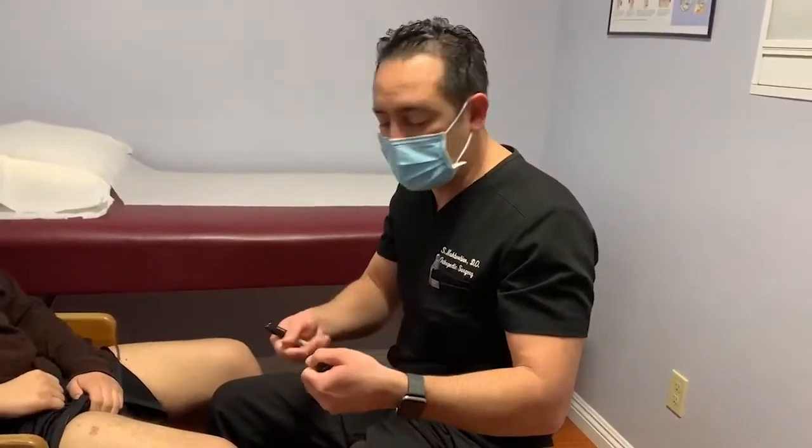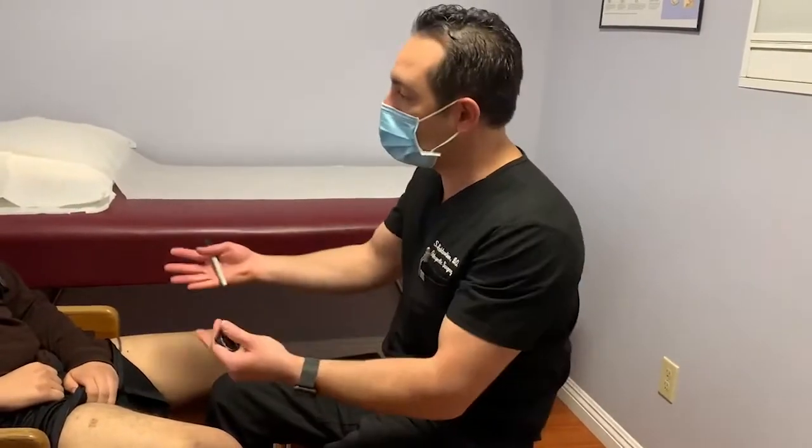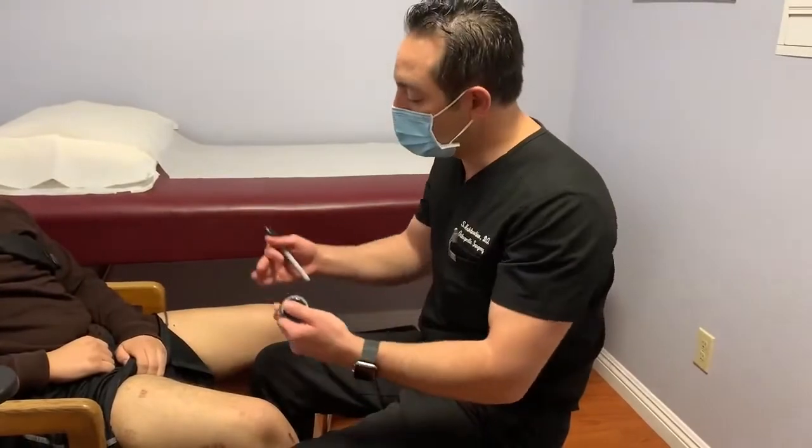If the magnet and the ERC are too far apart from each other, then the nail won't lengthen. So every time my patients come in, I re-measure and make sure that we know exactly where the magnet is.